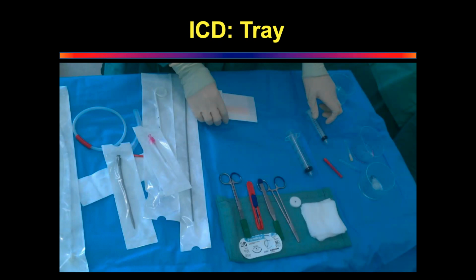Absolutely correct. So you actually have to thread the guide wire through the pigtail, and you should not start entering the chest till the guide wire comes to the proximal end of the pigtail. Okay, that is the most important thing. The guide wire must come outside the pigtail before you start putting it into the chest.